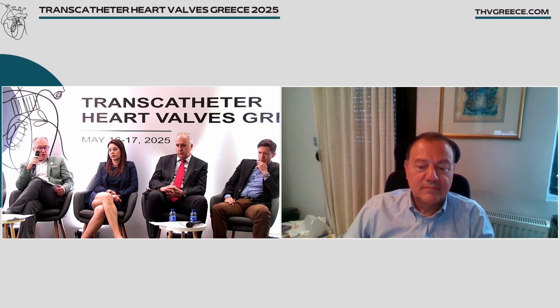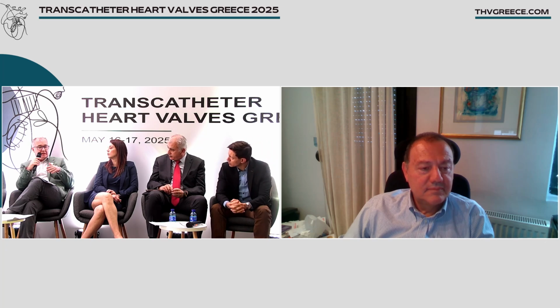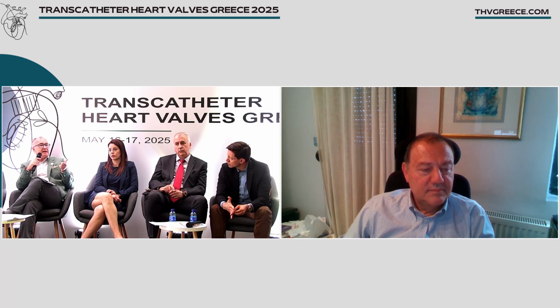Okay. Before going on to Dr. Ninos, can I say that a new balloon expandable valve in a self-expandable valve also corrects the transvalvular and the paravalvular leak in our experience. We had a case that had a severe paravalvular and transvalvular leak that was treated with a balloon expandable valve.